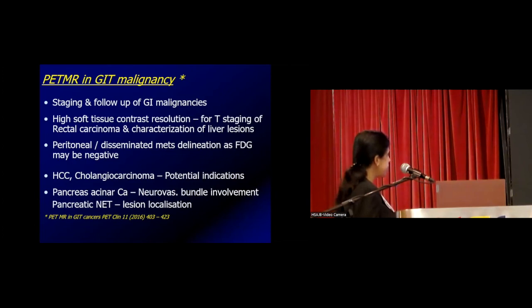And we are also very useful in the evaluation of hepatocellular carcinomas and cholangiocarcinomas. And also in patients with pancreatic malignancies, the lesion localization and neurovascular bundle involvement can be easily reported from a PET-MR.